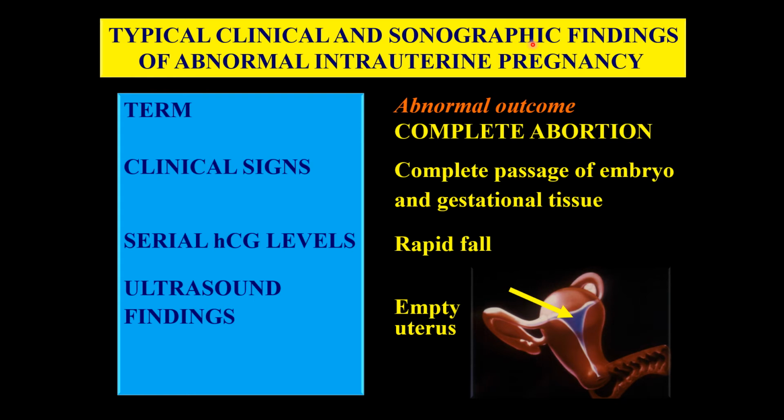If we can find the cardiac flicker, this is a normal finding very early in pregnancy. But if you are further along in the pregnancy, it may mean that the pregnancy has unfortunately failed if we don't find it. It is usual to be offered a further scan in 7 to 14 days to confirm the viability of the pregnancy.